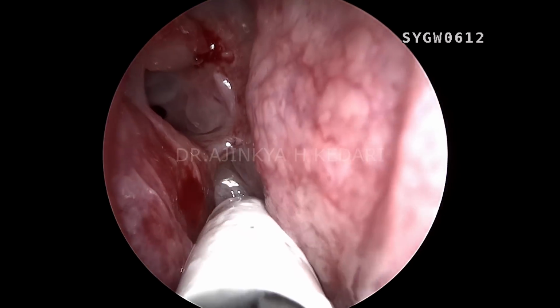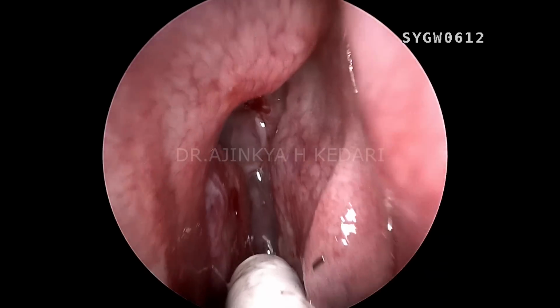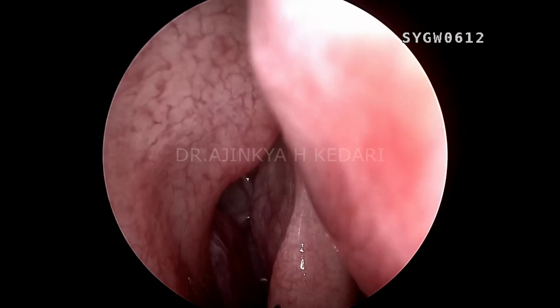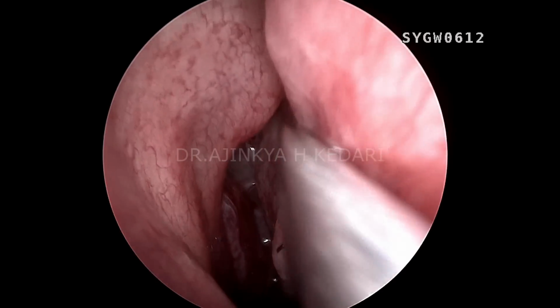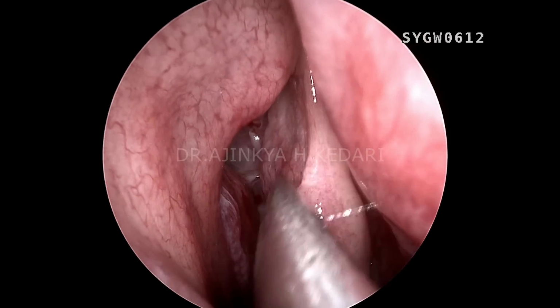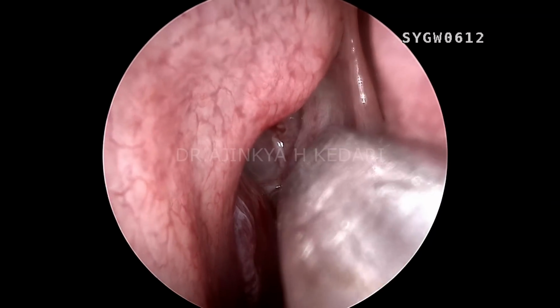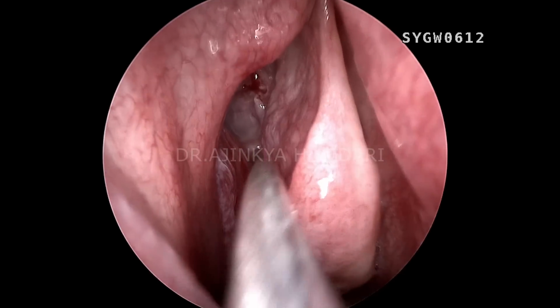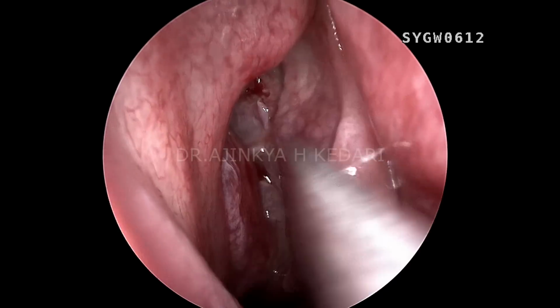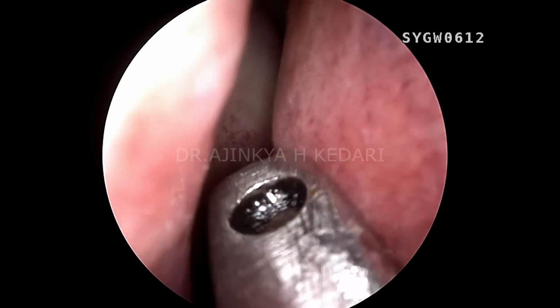You can see that's the middle turbinate, and possibly at the very center that's the anterior ethmoidal artery area. It looks like an anterior ethmoidal artery area, but not sure quite yet. So the very first step after decongestion was to evaluate the anatomy and look for the possible site of leak. What I'm going to do next is to expose the area much better. I might take away the lower 2/3 of the middle turbinate by keeping the upper 1/3 of the middle turbinate intact. This removal of middle turbinate is definitely not going to hamper any anatomy inside.